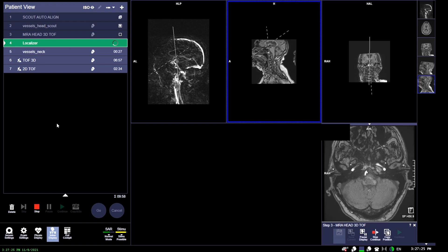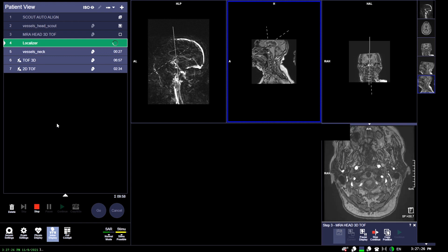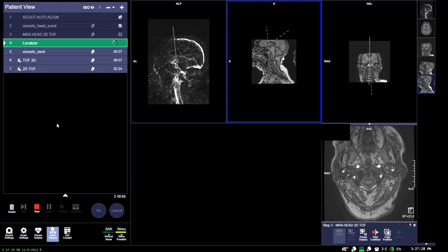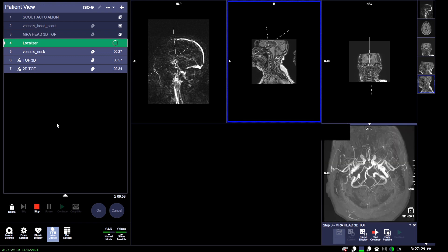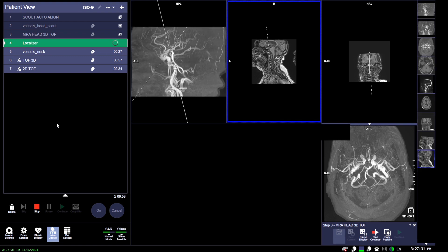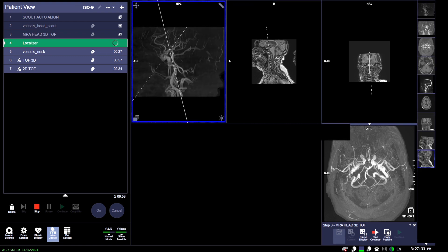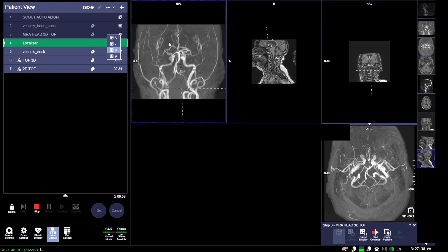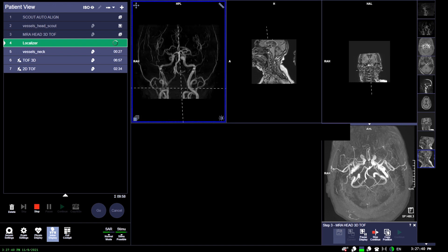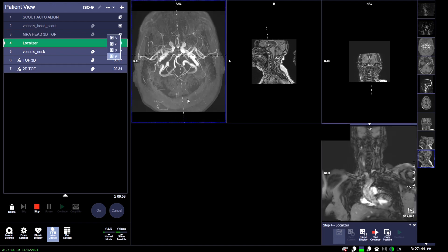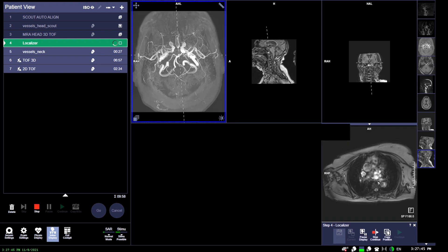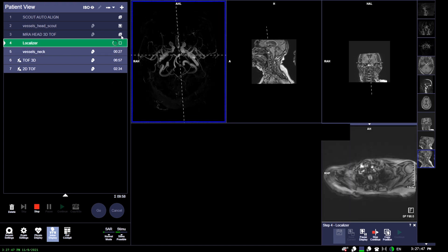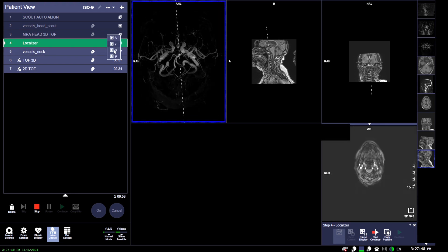That source image here is on the bottom right that we're scrolling through just to make sure that there is no motion or degrading of image quality. We can see we're sort of highlighting it out. Then what you would do is take this and post-process it—you would do something called a tumble and a rotational view. You would send that to the radiologist as well, so you're seeing specifically the arterial flow of the brain.